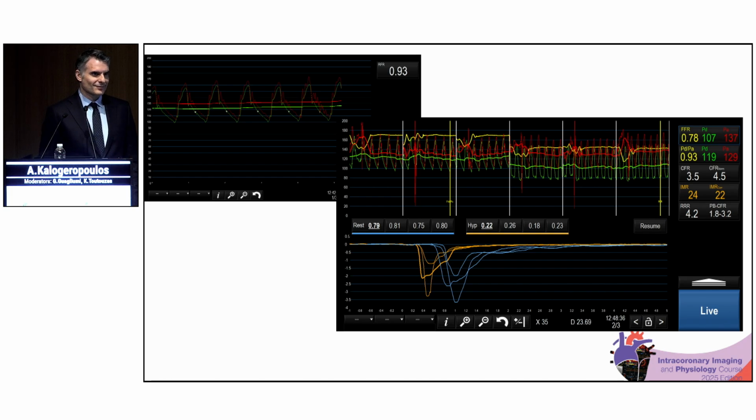I will go with FFR. Okay, we are going with the FFR. It is positive. Just make this point because we need more physiology information. He did the physiology, he did the full physiology. Now we have some discrepancy based upon FFR and then the decision.